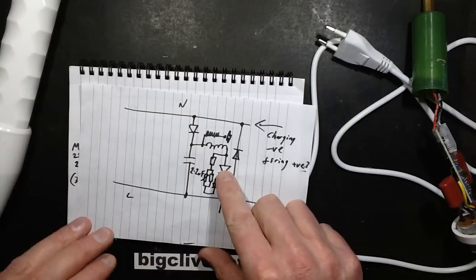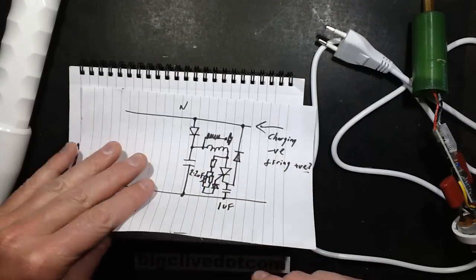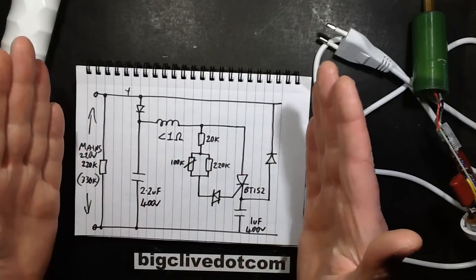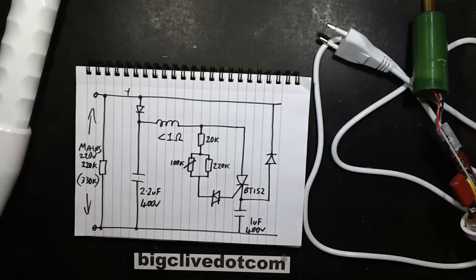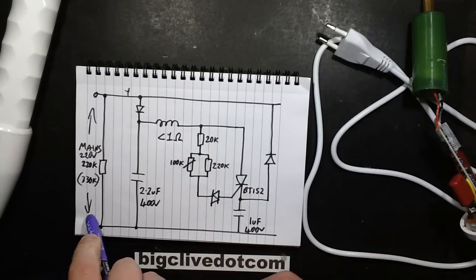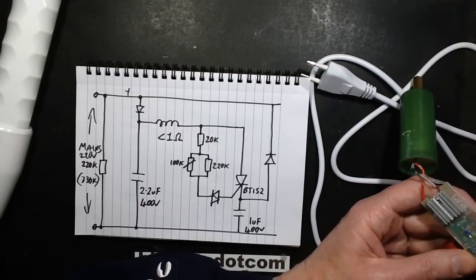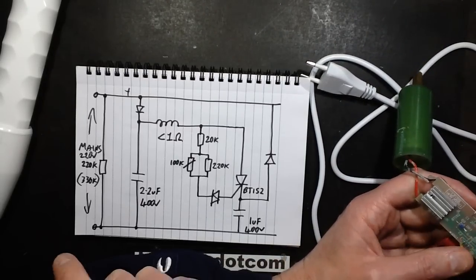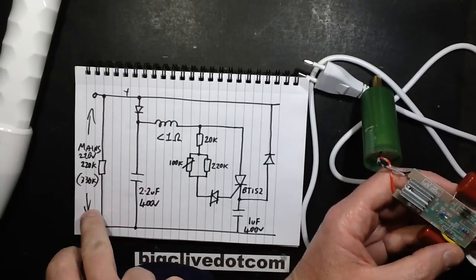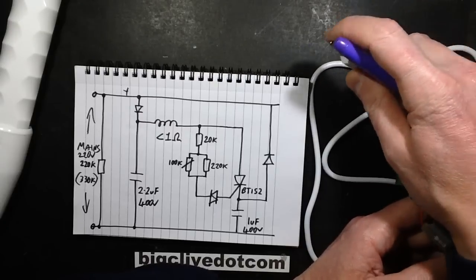Then I did the first doodle from that, which initially didn't make a lot of sense because there's quite a lot happening. So once I'd worked out what's happening, I drew this doodle, which is much clearer. The mains comes in here, and it's designed for 220 volts, but I think it would still work at 110, 120 volts, because it would just run at a lower level. The first thing is this resistor here is across the mains, and that's purely a discharge resistor. It's for safety, so when you unplug it, you're not going to get a tingle off the pins from the capacitors.